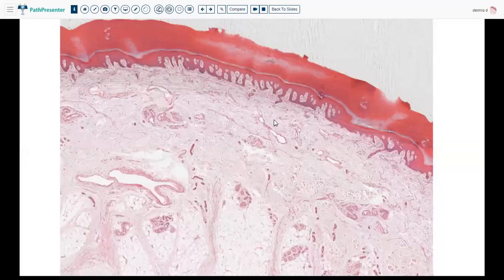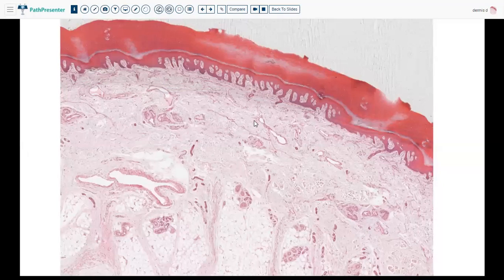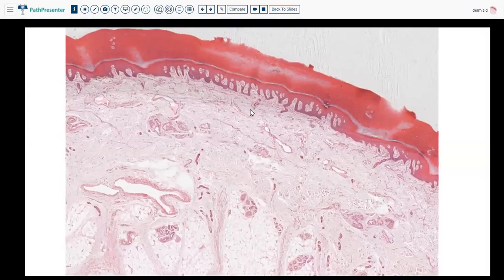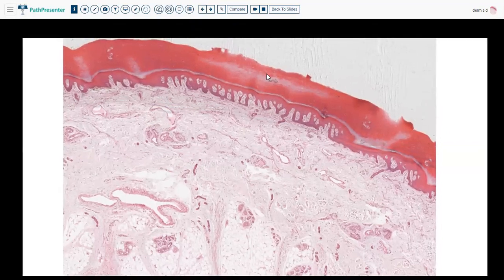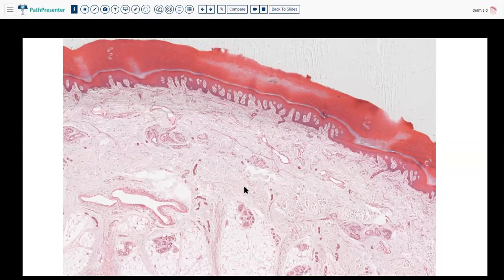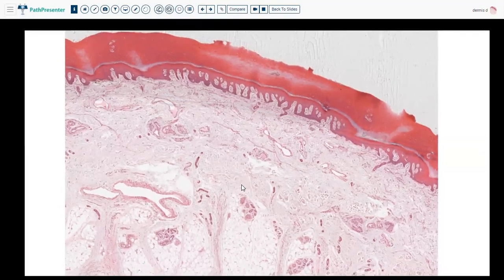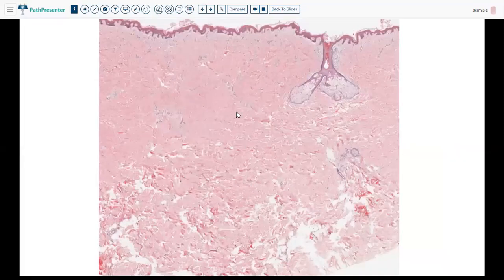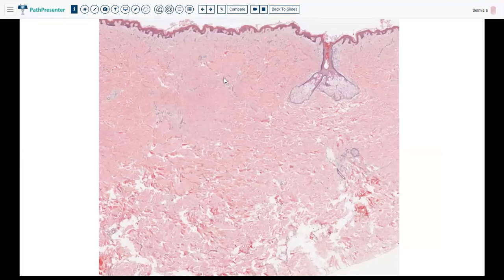Now that we talked about the abnormal, let's talk about the normal again. With the acral skin, just like it can have a thickened stratum corneum, the dorsal hand, for example, can have a thin dermis compared to other body areas — don't be fooled into thinking it's dermis atrophy. And there are other parts of the body, like the back, where you can have the thickest dermis in the whole body. See how tiny the epidermis looks — it's a very thick dermis, but this is completely normal in the back.